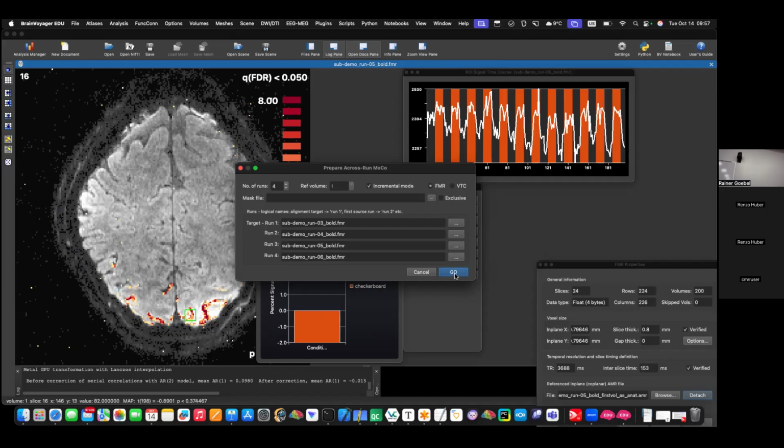And if you go then to the fourth or so, or middle, it's usually less saturated. So normally the first are slightly better, but it doesn't matter too much, right? But you're right, if I align to run 4 later on, I could also use run 4 here just to be consistent. And that will be enabled.